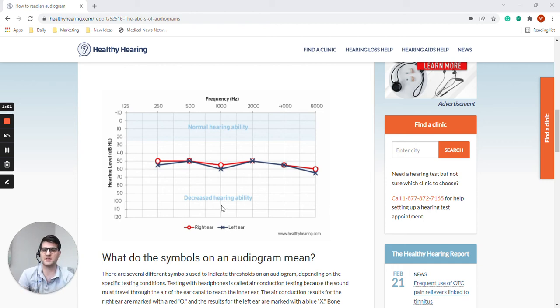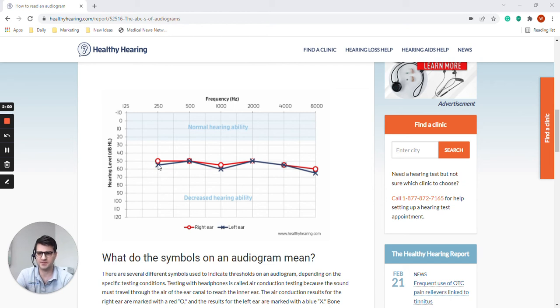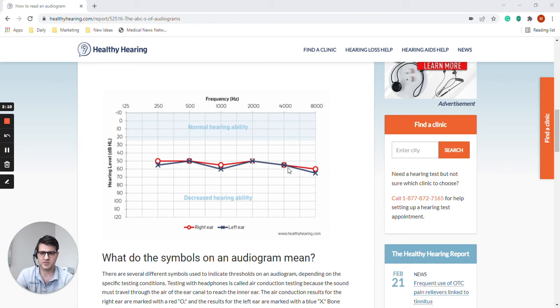As you can see here, this person in doing this test got these results. What this means is that this person, the lowest possible sounds they heard were around 50 dB, 50, 55, sometimes 60 for each one of these different sounds.